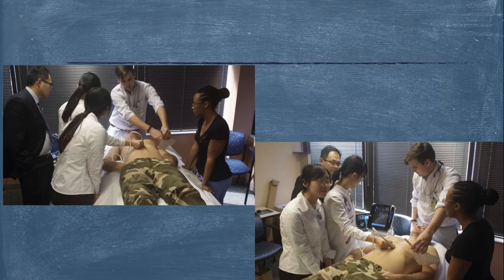So here's an example of some residents teaching some of our international exchange students ultrasound. And you can see they're not grabbing the probe from them and they're using the probe tool, which was definitely a helpful tool, particularly with the language barrier.